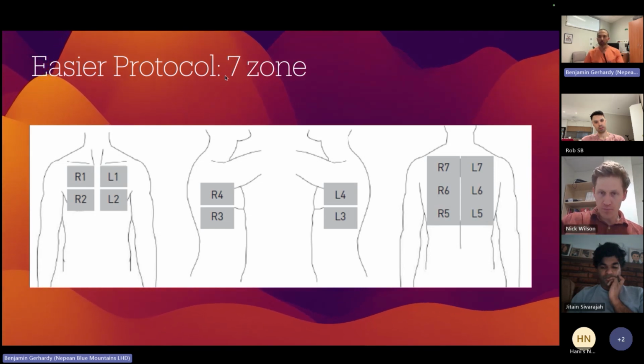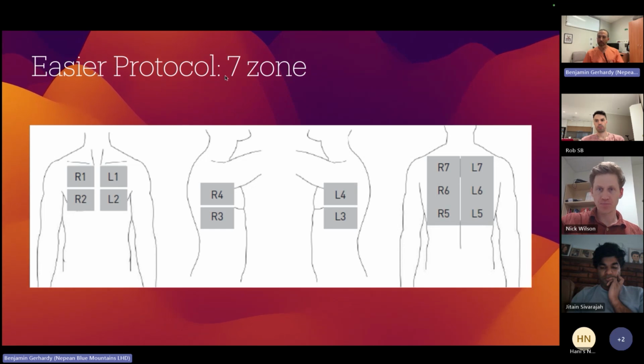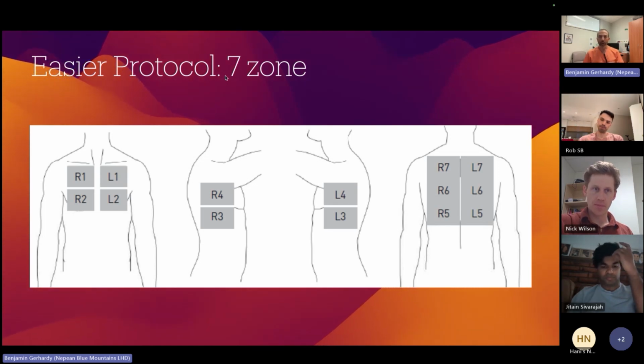If you want to go down the road of learning that, it becomes a sort of pattern recognition thing, and to think about, okay, I've seen A lines or B lines or whatever. I think that being comfortable, at the very least, to scan more of the lung fields themselves, just taking the probe and effectively lawnmowering it over the hemithorax, is a really good way to go, because you get to see more and you can miss subtle things.